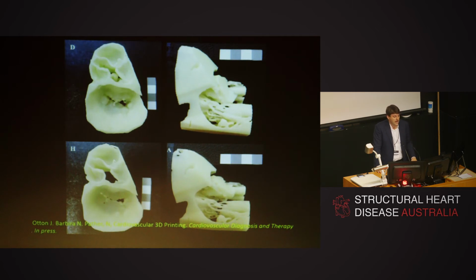If you go outside, there's some examples. Nicolette, a hardworking honour student, has been doing some 3D printing of mitral valves, and we've got examples of many different kinds of 3D prints. And this is some anatomical specimens of a mitral valve which have been CT scanned, and we can 3D print those for teaching, and that's very easy to do.